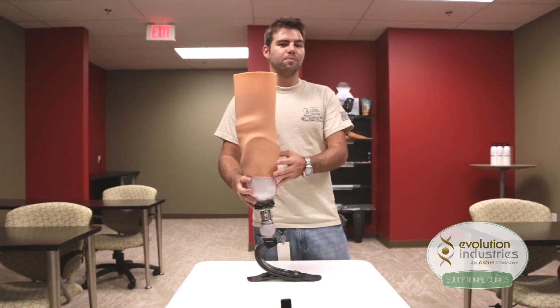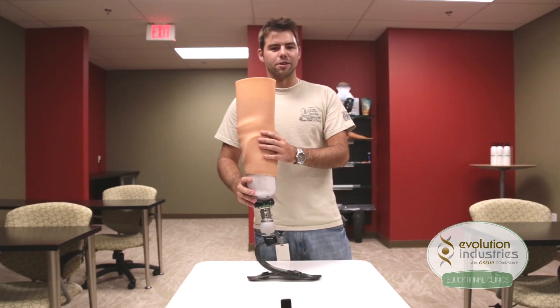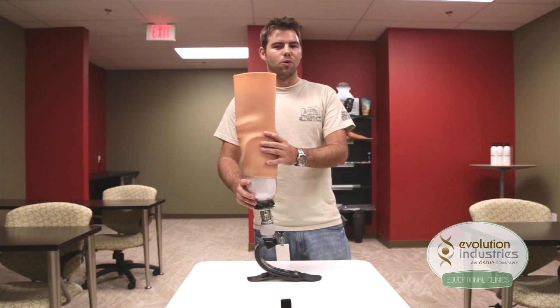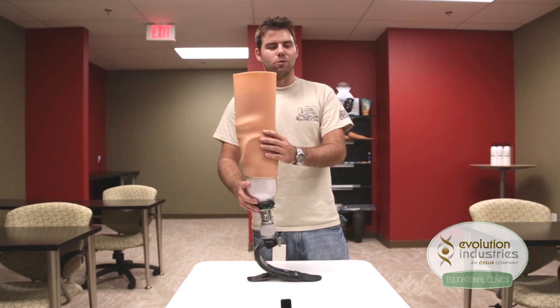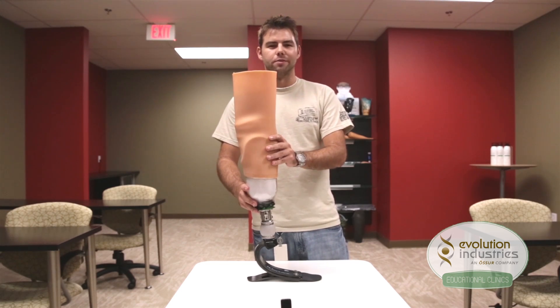So in conclusion, this simple expulsion system uses just three parts and is very easy to maintain. These parts can be ordered individually as opposed to a whole kit. It also gives you the four-hole setup to attach other distal components. If you do have any questions, please call us at Evolution at 1-888-839-6213. Thank you.